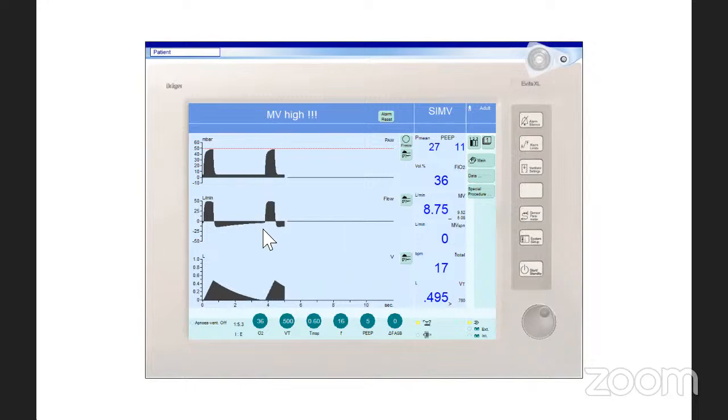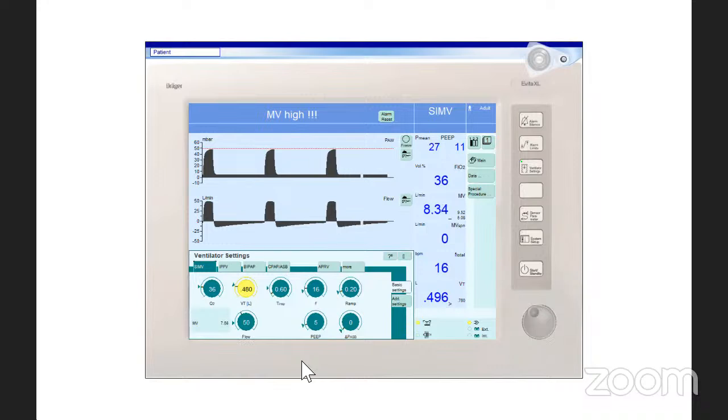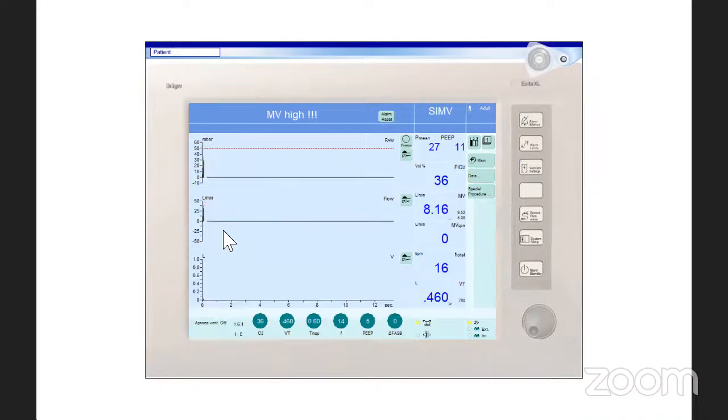So now let's go down slightly on the tidal volume to 460 and go down on the rate to 14. You can see here that the dynamic hyperinflation is almost completely resolved.